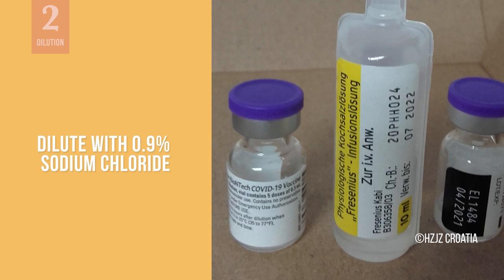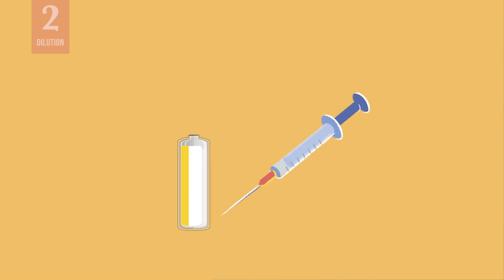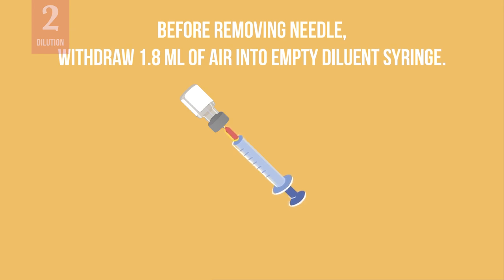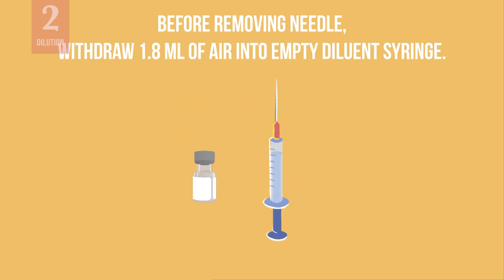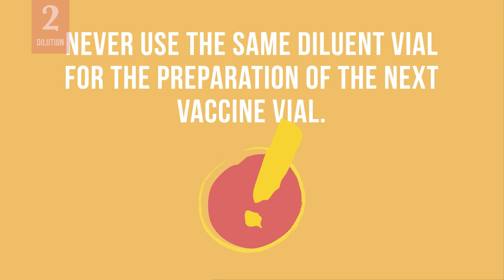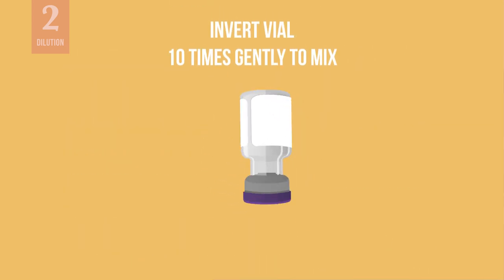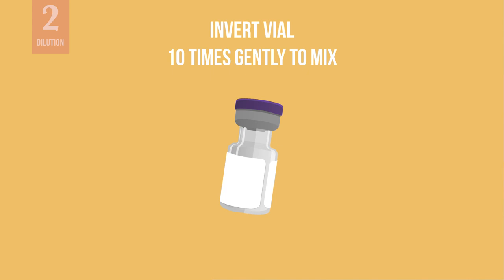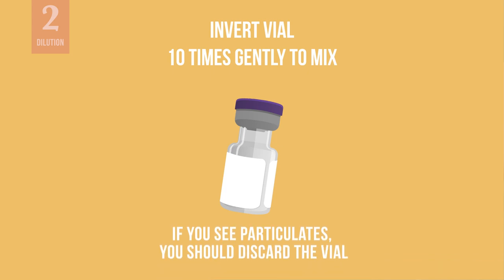This is the only diluent that should be used with the vaccine. Look carefully at the syringe graduation marks to verify that the correct volume is withdrawn. Add the diluent to the vaccine. Before removing the needle from the vial, equalize the pressure inside the vial by withdrawing 1.8 ml of air into the empty diluent syringe. Dispose of the mixing syringe and diluent vial with remaining diluent immediately. Never use the same diluent vial for the preparation of the next vaccine vial. Now gently invert the diluted vaccine 10 times. Do not shake the vial so that the vaccine would not foam. The diluted vaccine should appear as an off-white solution with no particulates visible. If you see particulates or if the vaccine is discolored, you should discard the vial.